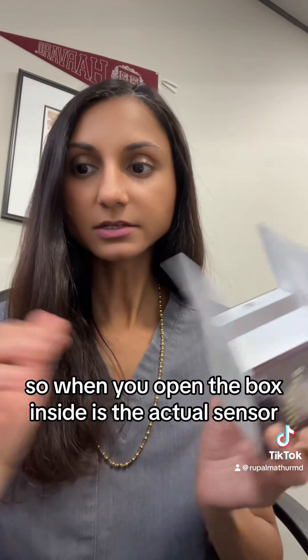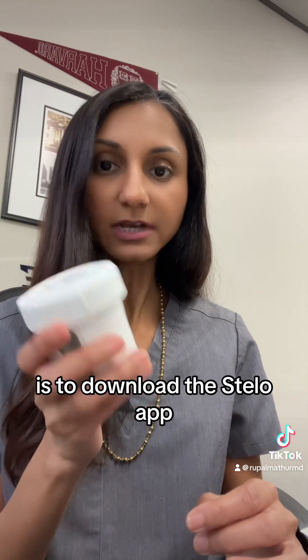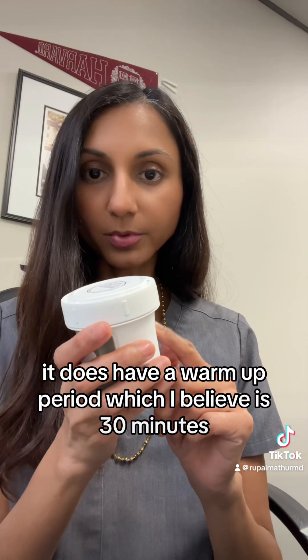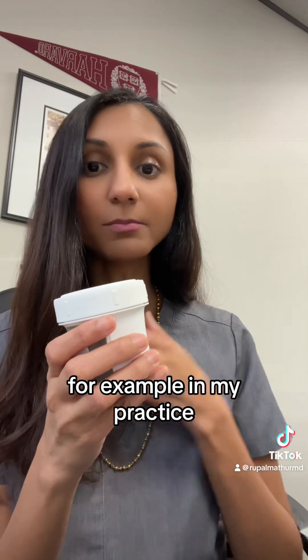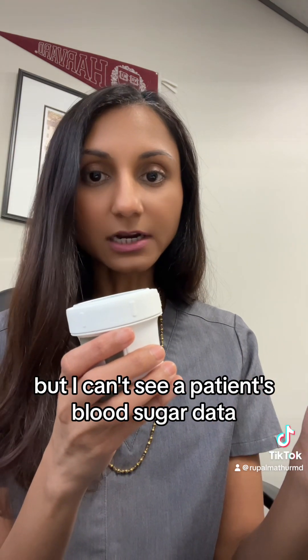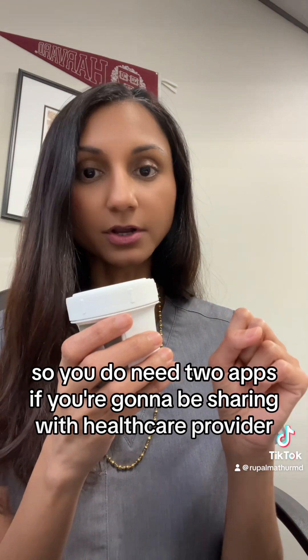When you open the box, inside is the actual sensor, along with a packet of information and an outer patch. You're going to want to download the Stelo app and be ready to scan your sensor once it's on your skin so that it can be activated. It does have a warm-up period, which I believe is 30 minutes. Keep in mind, you need to download both the Stelo app and, if you want a provider to review your numbers, the Clarity app. In my practice, I use continuous glucose monitors all the time as an accountability partner to patients, but I can't see a patient's blood sugar data unless they also download the Clarity app and put in my practitioner code to share their data. So you do need two apps if you're going to be sharing with a healthcare provider.